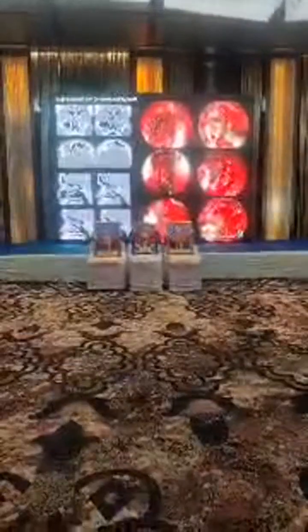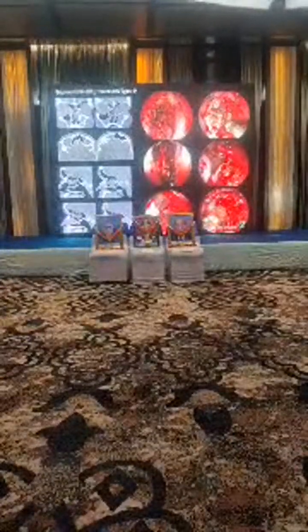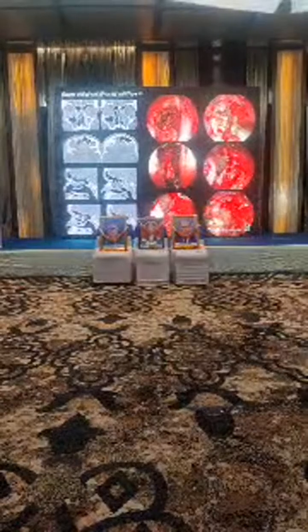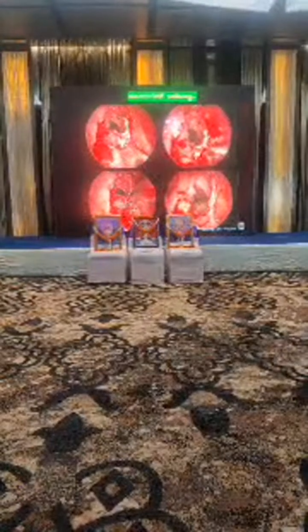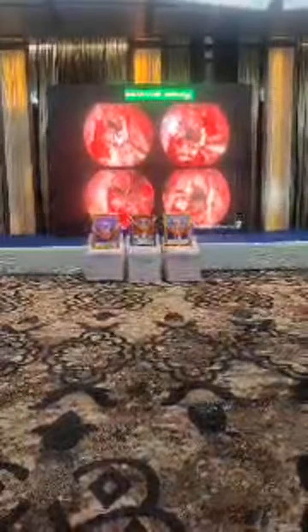On the other side also, you can see there is a very small frontal sinus drainage pathway. If you open that cell carefully, if you remove this lamina, you can enter the frontal recess, frontal sinus. Then the frontal sinus drainage pathway. See here, this is the other cell, one more cell over there, and this is my probe going in the frontal sinus drainage pathway.